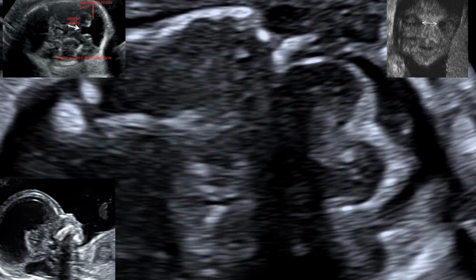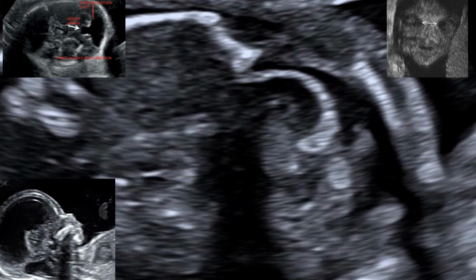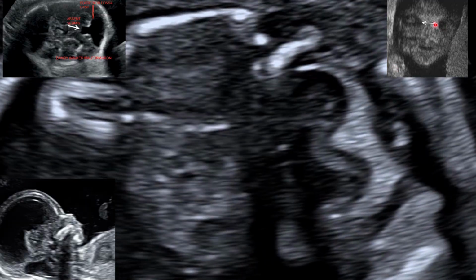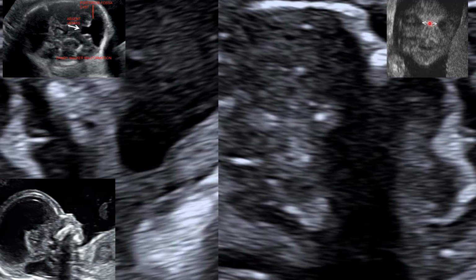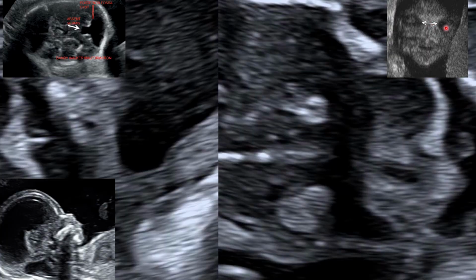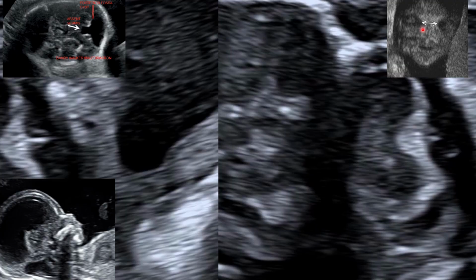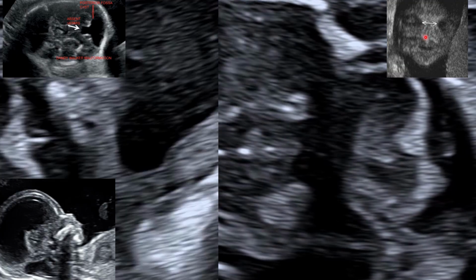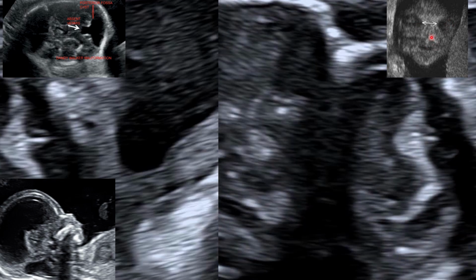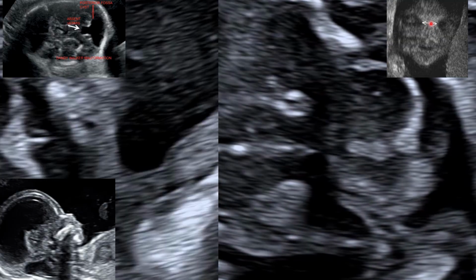It is because if the interorbital distance is above 21 millimeters, that is called hypertelorism. The interorbital distance should be between 9 and 21 millimeters. Anything that is above that is hypertelorism. If it is less than that, then it's what we call hypotelorism. So the distance between the orbits of the eyes, that's the eye, that's another eye, that's the mouth of the baby. So you have to check also the interorbital distance.